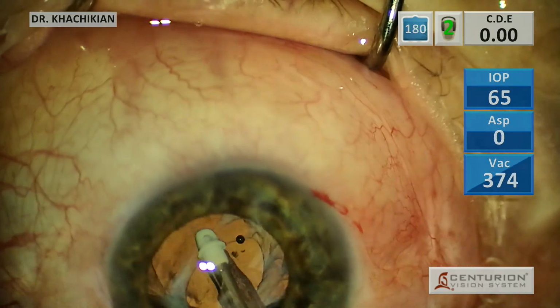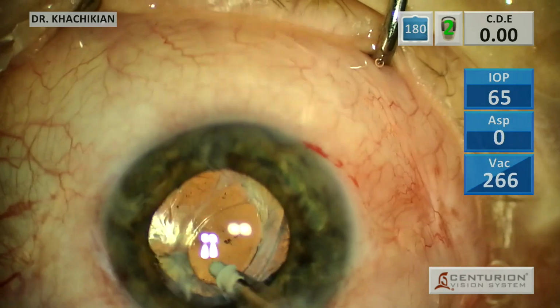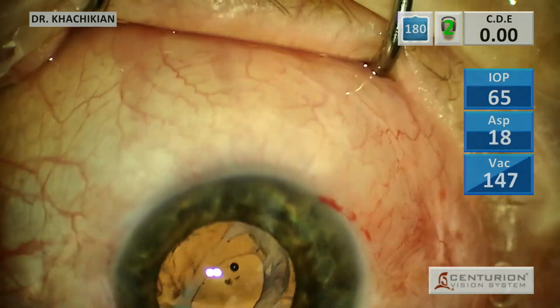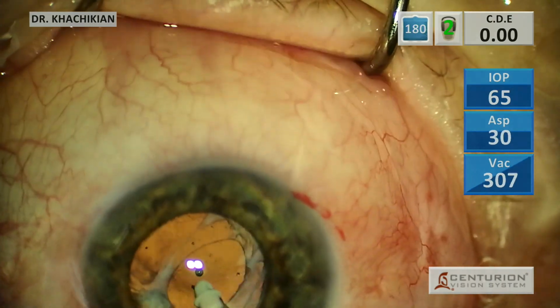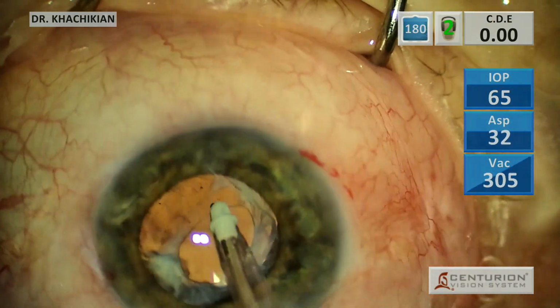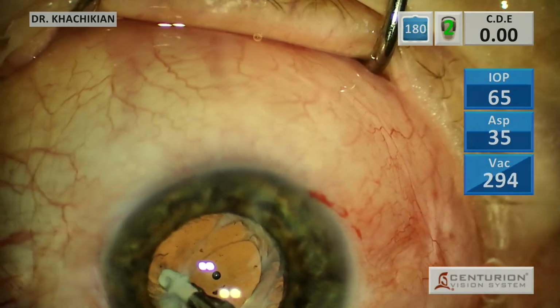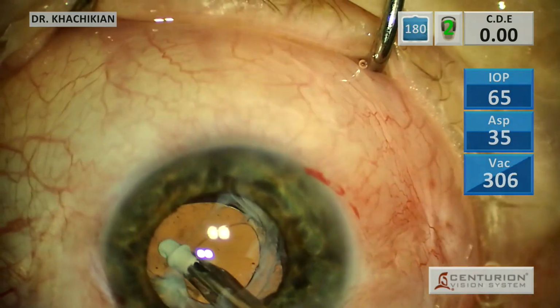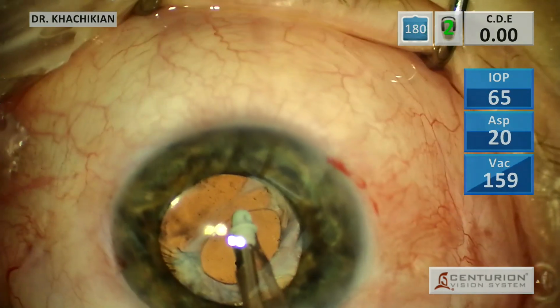And that's what we want. And spend a lot of time just trying to get out any residual cortical material that I can see. Now, how old is this case? How long ago did this cataract surgery get done? It's probably just over a year.